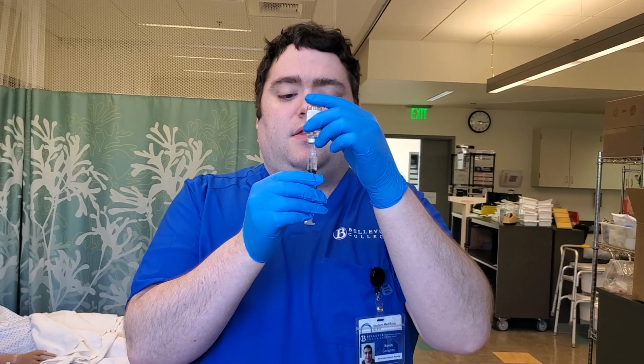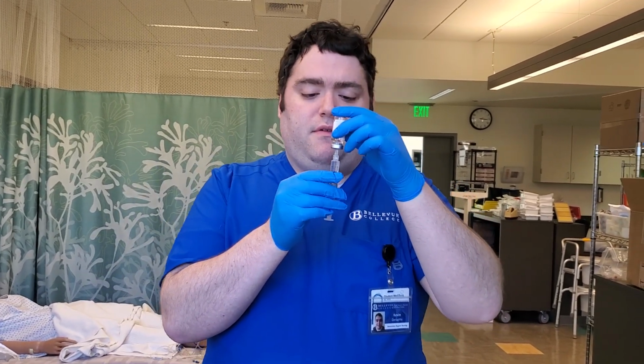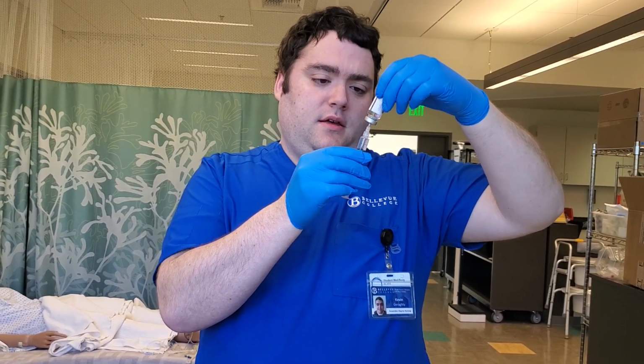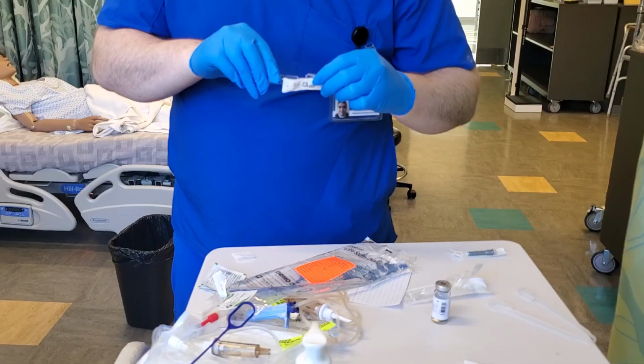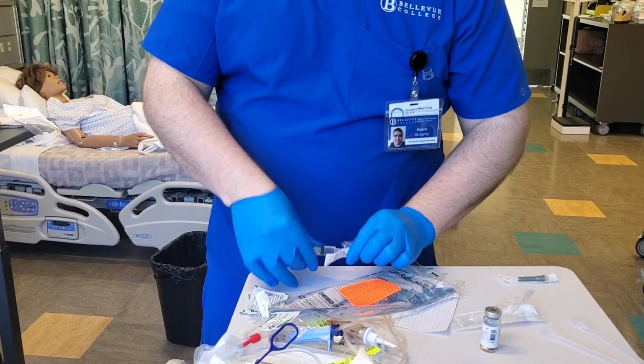As you can see, we have the right amount of med in there. We'll say for this purpose that I had drawn it correctly. Okay, so it's good. We'll go ahead and cap this.